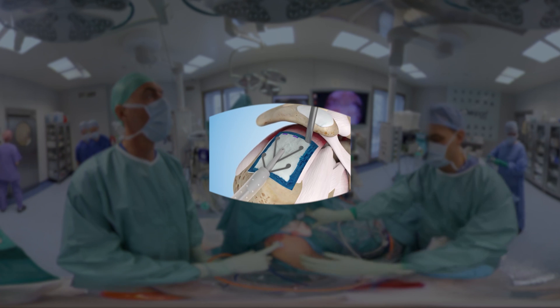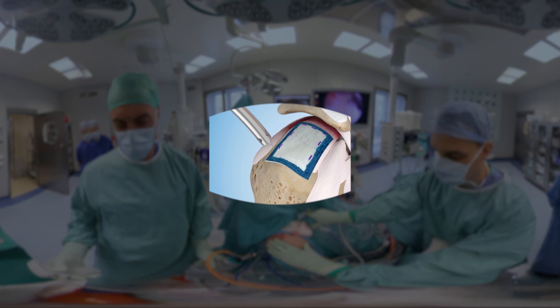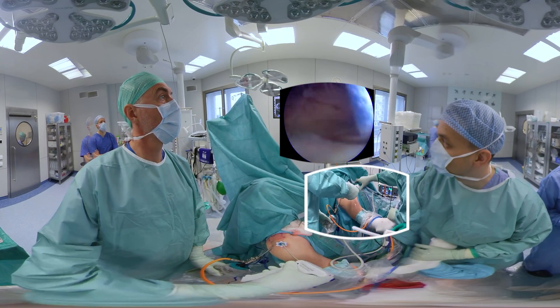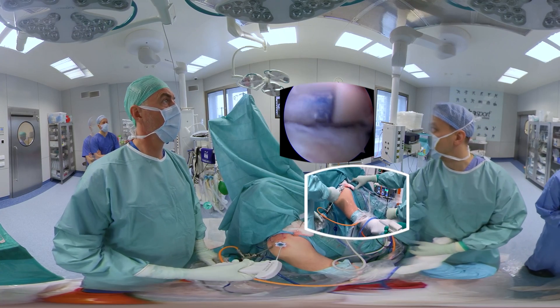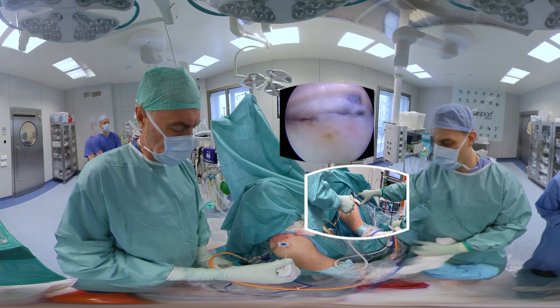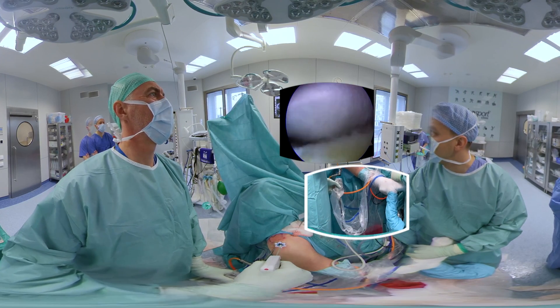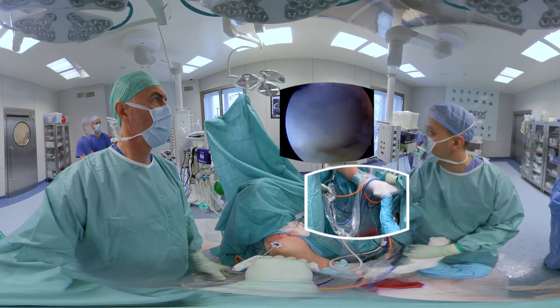The bioinductive collagen implant Regenetin is used after the supraspinatus tendon has been fully repaired. The whole set includes all necessary implants. First, a special short and wide cannula from the set is inserted through the anterolateral portal to help with easy passage of the delivery device. Then the delivery device is inserted. Before implant delivery into the subacromial space, the black save button on the gun needs to be released. Once we are squeezing the trigger, the plastic tube retracts and the implant slowly spreads and deploys.